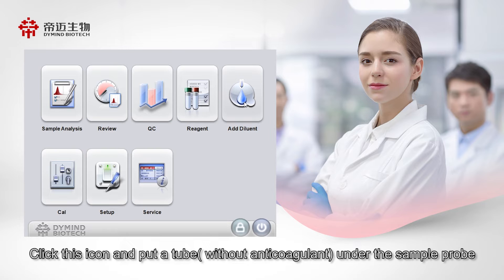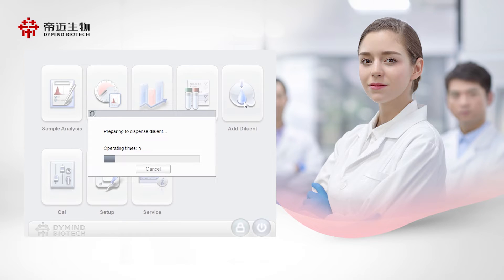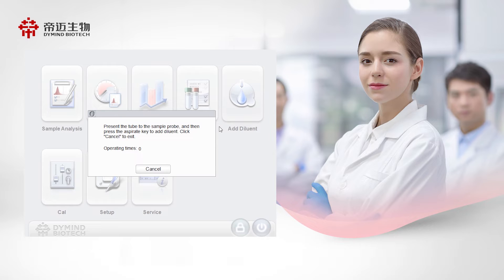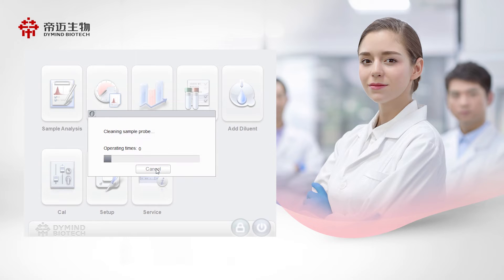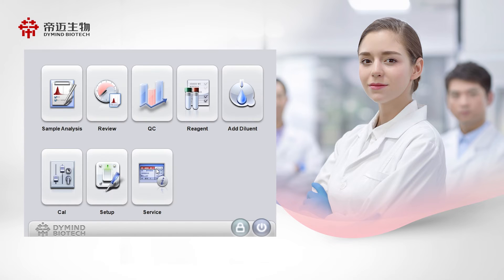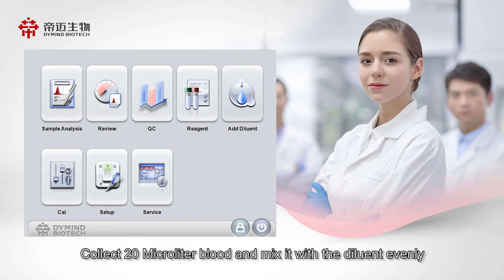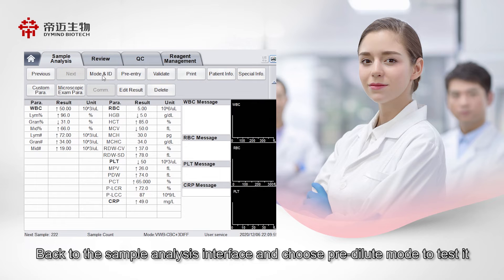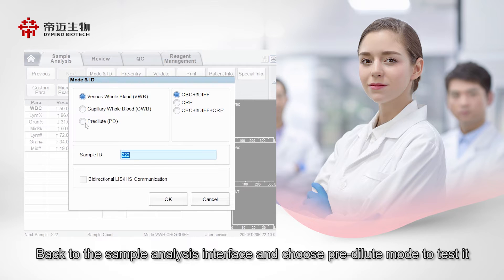Click the Add Diluent icon and put a tube under the sample probe, then press the aspiration key cover once to collect 480 µL of diluent. After that, click Cancel. Collect 20 µL of blood, mix it with the diluent evenly, then go back to the sample analysis interface and choose pre-dilute mode to test it.